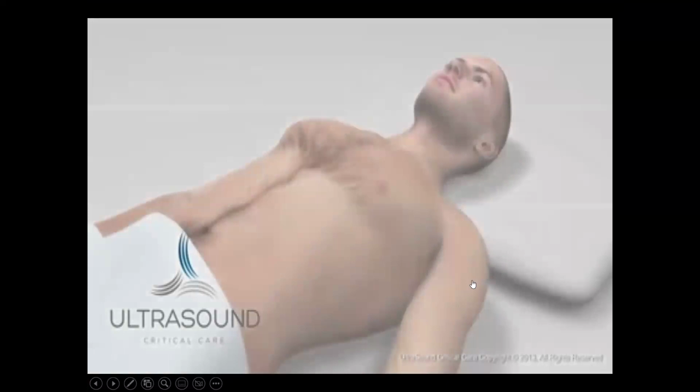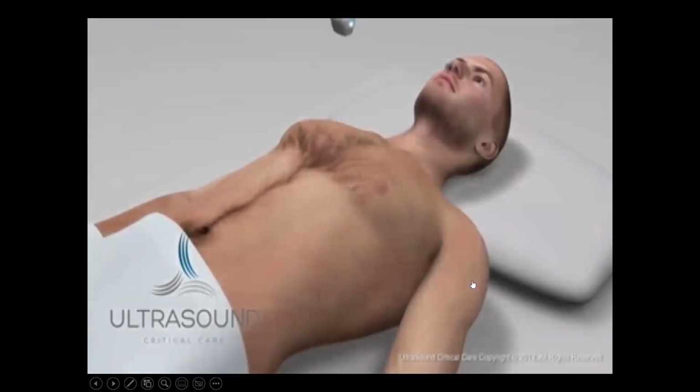I will show you a short video of how to assess your IVC easily. Here the patient is supine, as we said.